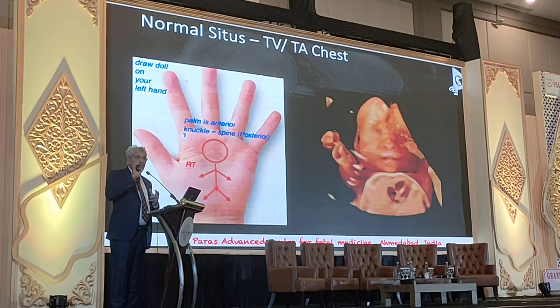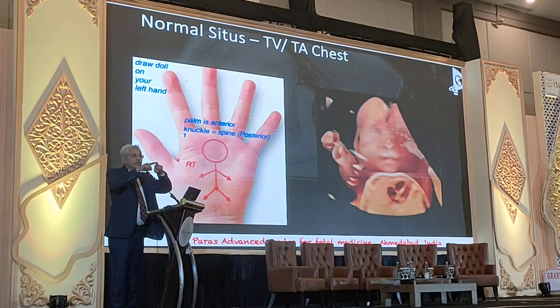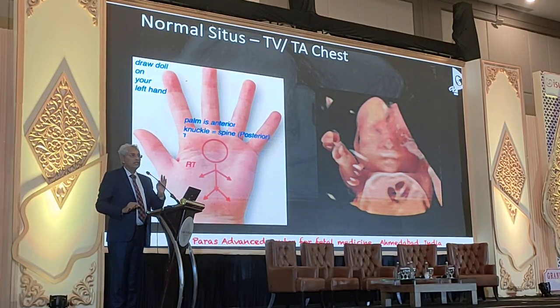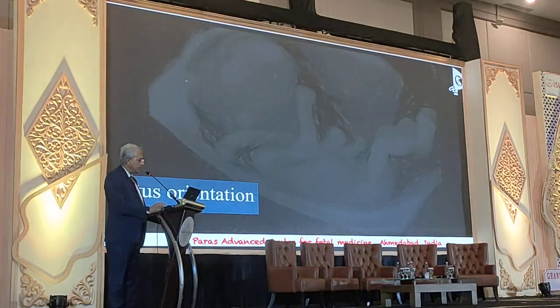It is not synonymous that stomach is on left side and apex of the heart should be on left hand side, on the same side. It's not like that. You have to identify fetal left and fetal right side first. Then on left side, you should be identifying, okay, stomach is on left side, the apex of the heart is also on left side, and point of the tracheal V formation, that point also should be on the left hand side. These three things should be on the left hand side. The moment you have done this, you have ruled out more than 60 to 70% of the cardiac defects, and that's what my aim is.